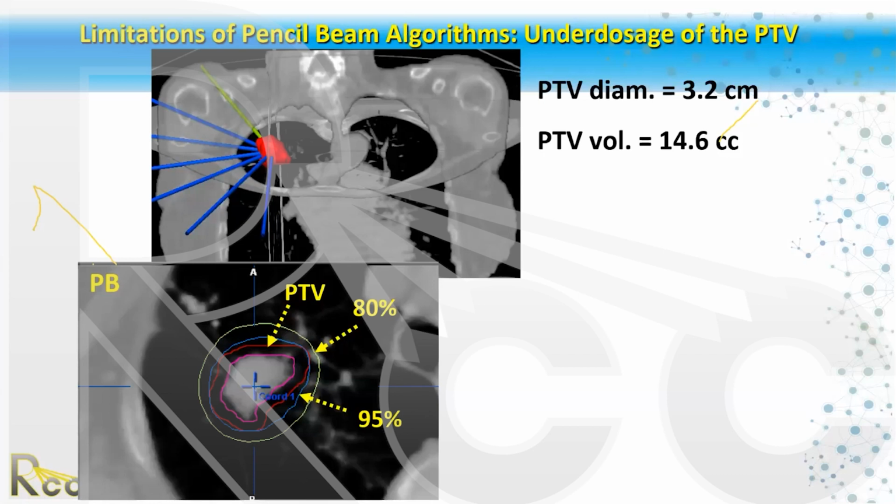For larger tumors where you're dealing with locally advanced lung cancer, we can go to 10 or even 15 sometimes, depending on the habitus of the patient. If there's a larger separation, the larger energy helps. But for SBRT, we're typically using 6x. Okay, great, thank you. Sure.